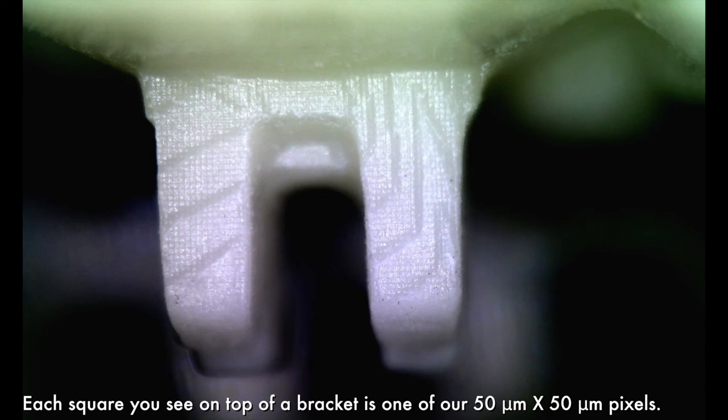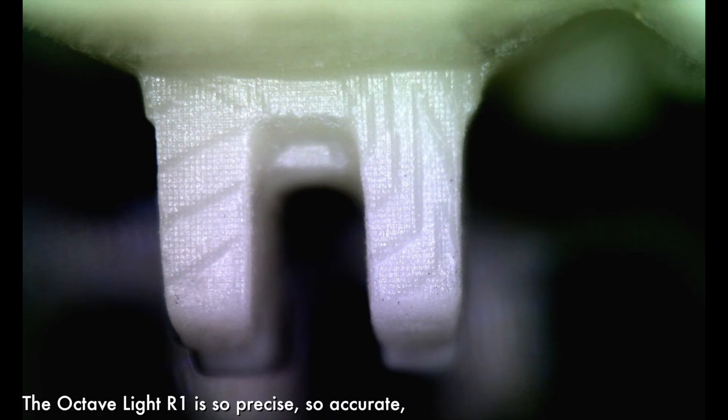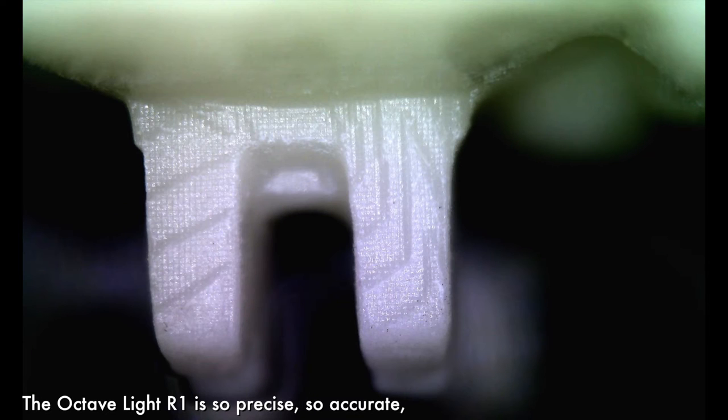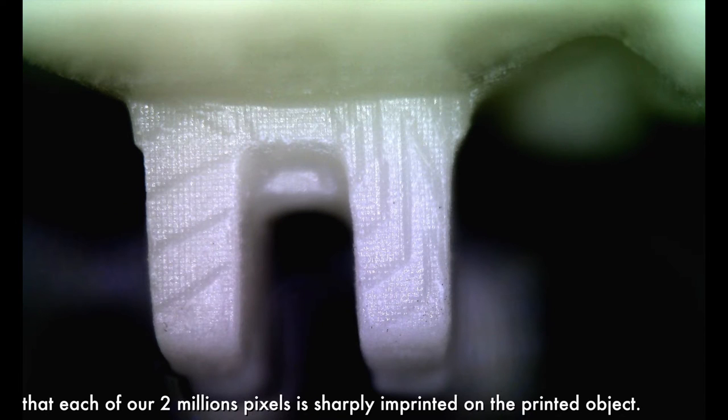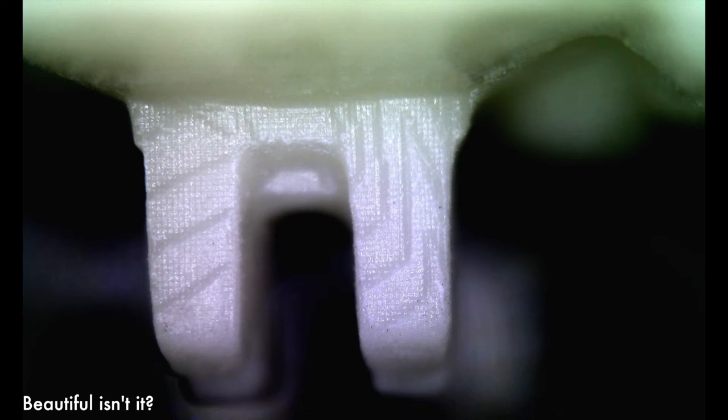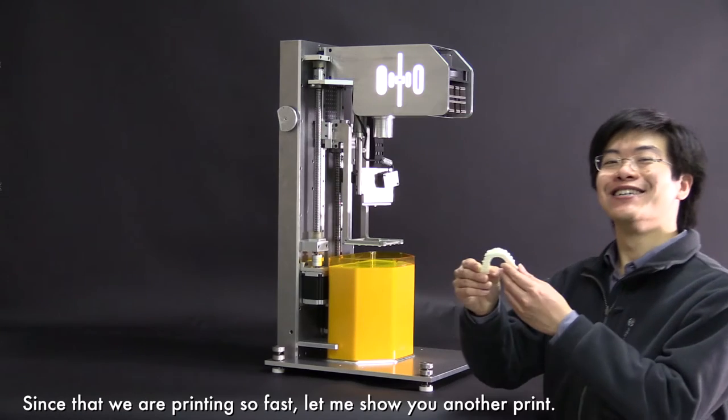Let's look at the top of these brackets. Each square you see on top of this bracket is one of our 15 micrometer by 15 micrometer pixels. The Octav Light R1 is so precise, so accurate, that each of our 2 million pixels is sharply imprinted onto the print object. Beautiful, isn't it?